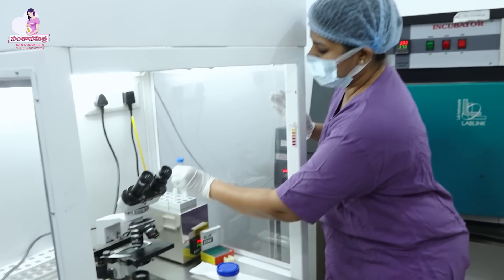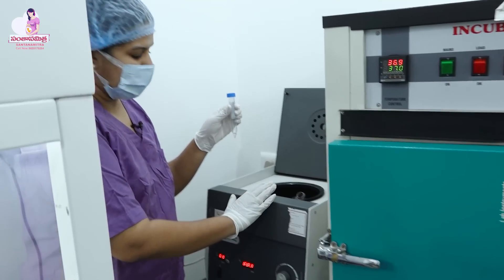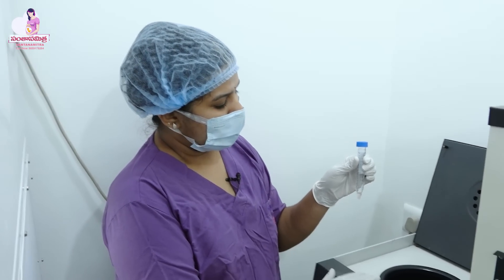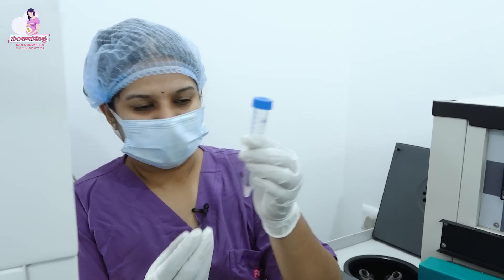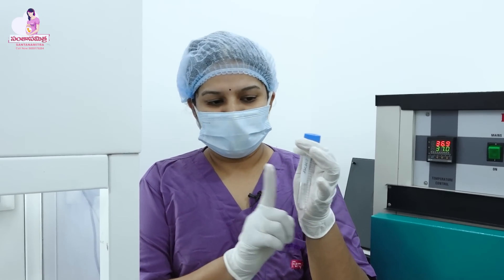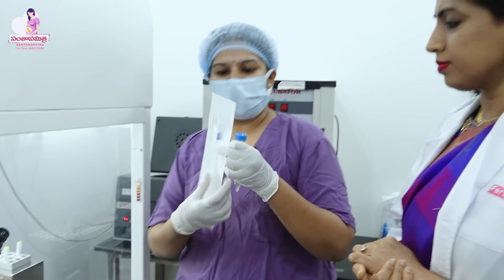We are going to use a centrifuge here. We have already prepared a sample. We will check the patient name twice. After checking, we are going to load it in an IUI catheter.